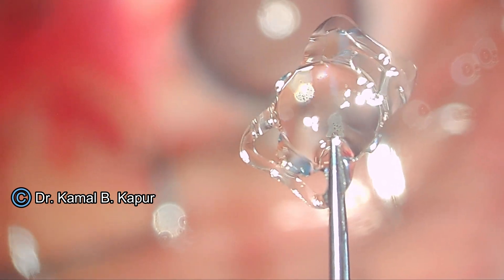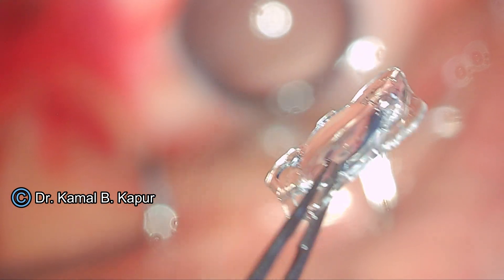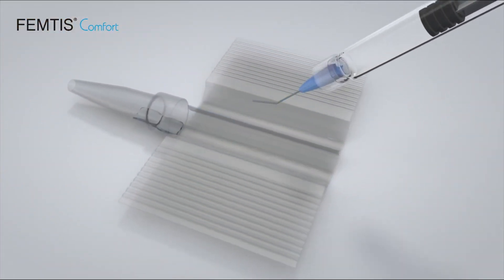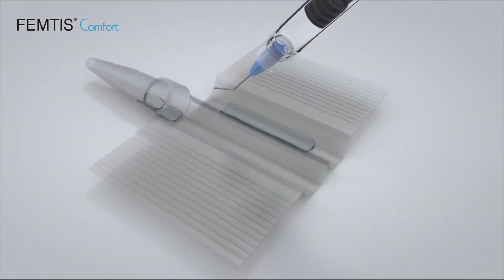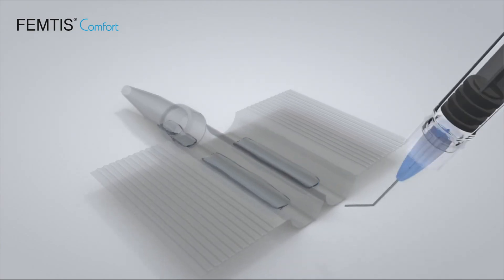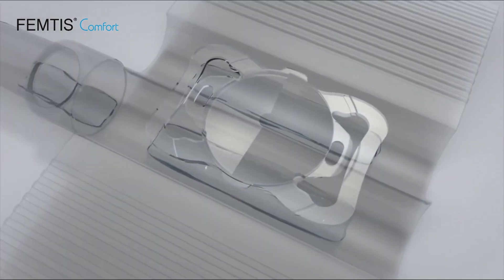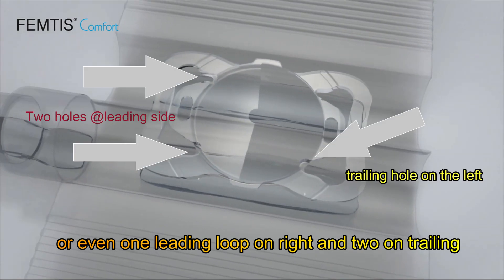This is how the Femtis IOL looks like. It has four flanges — the two larger flanges will rest on the anterior capsule, and two smaller flanges on the side will also rest on the anterior capsule, which makes a rock-steady IOL implantation onto the capsulorhexis margin with zero rotation.